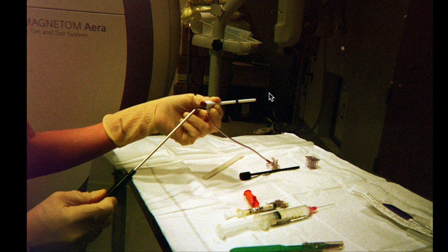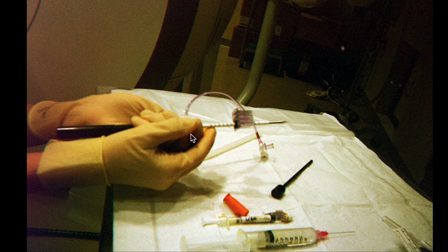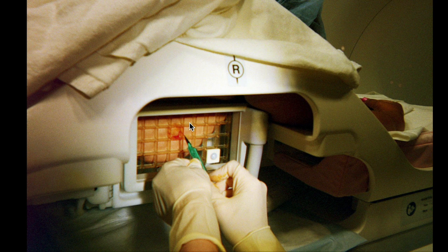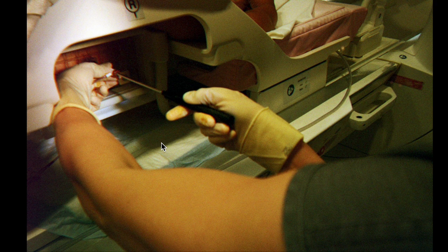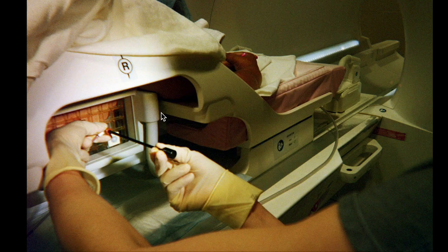Put the needle inside the introducer. Yep, there I am. Needle inside introducer, and the introducer is in the hole of this 9-hole plug. So I make my incision with an 11 blade, put it in deep and quickly. Then I put the needle, which is inside the introducer, which is inside the block, in the correct place. So it was like the bottom right. I make sure this is straight, going straight in.